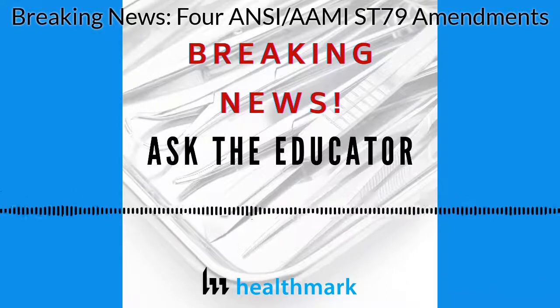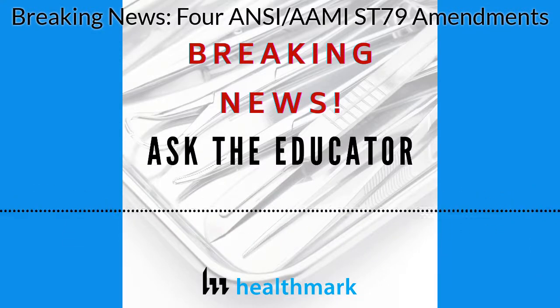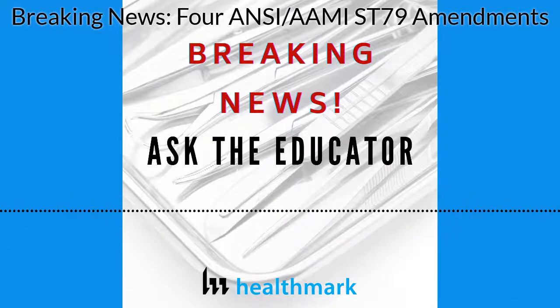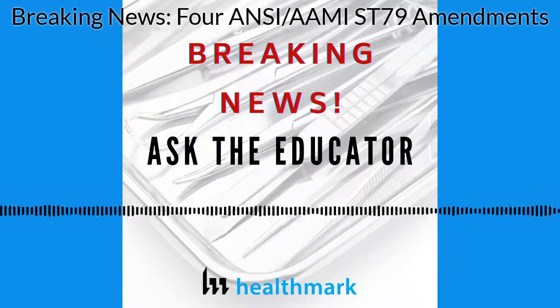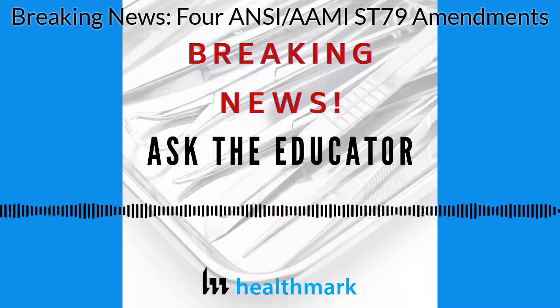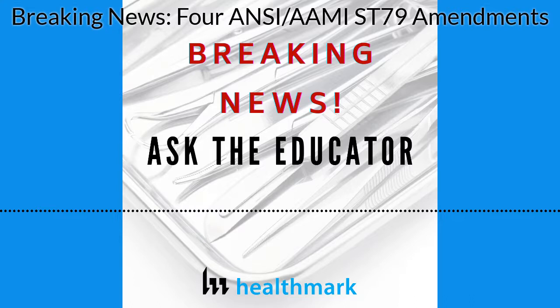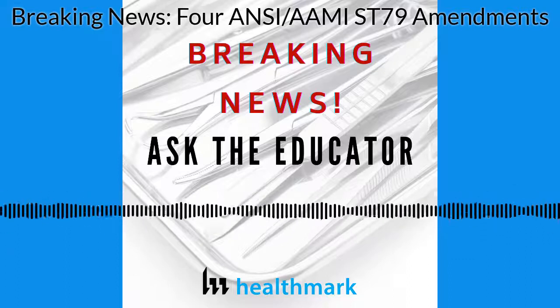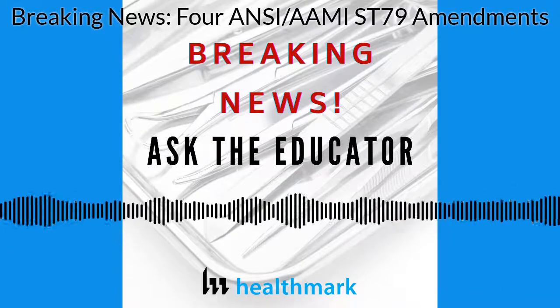So what are some of the big changes? Well, we need to be inspecting these types of instruments' external surfaces with lighted magnification. We need to check the insulation integrity each time these devices are processed. Cables and cords that are used to hook up to these types of instruments may also be a source of concern and should be inspected for integrity and continuity.